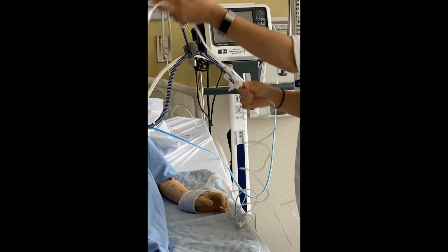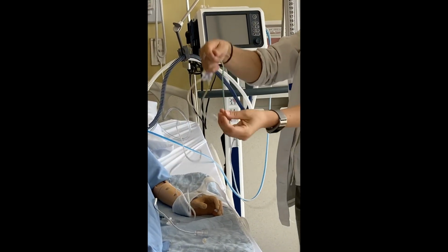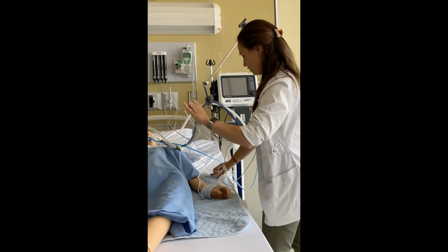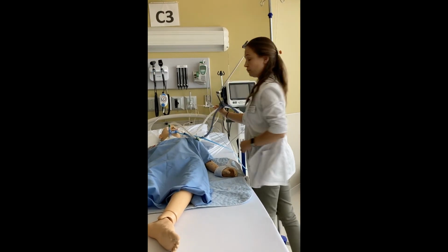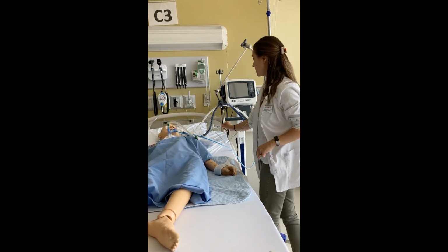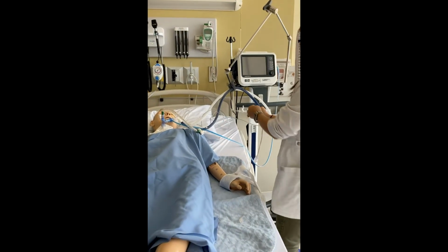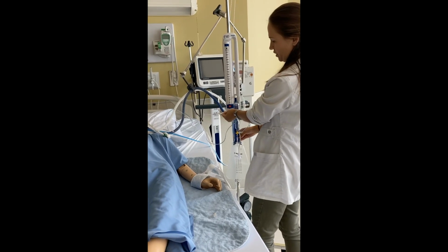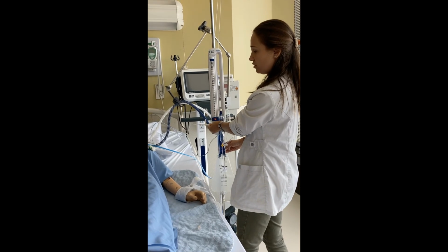Okay, this would connect to the monitor, and now a drain connected here sits in the patient's ventricle, and I'm measuring my intracranial pressure with this transducer, and it is a lot easier for me to level the transducer to the patient's tragus. Sometimes this transducer will be taped directly to the patient. Sometimes the transducer will be taped to the monitoring system like so, but this is just one of the ways to set this up. You are still able to drain CSF and measure the intracranial pressure.